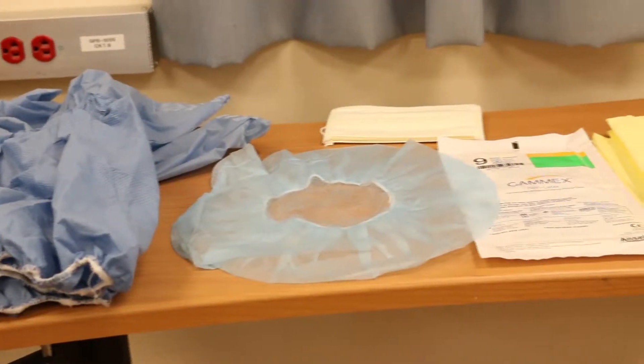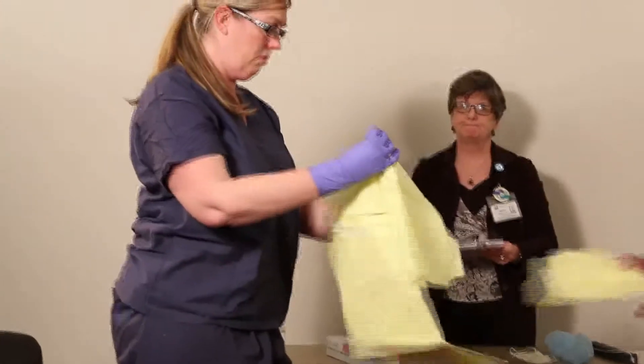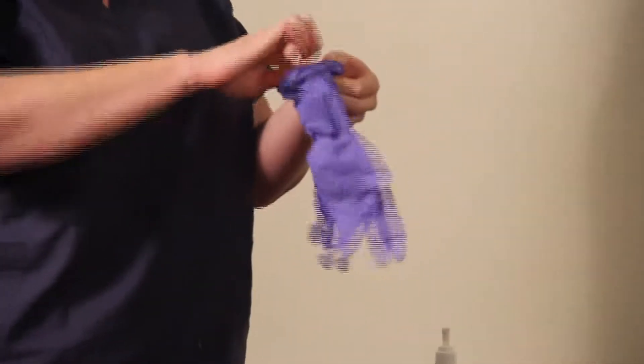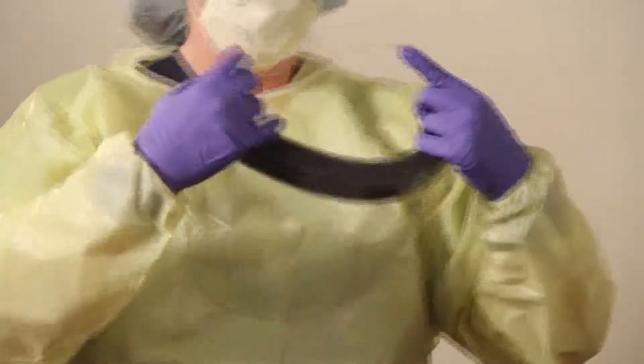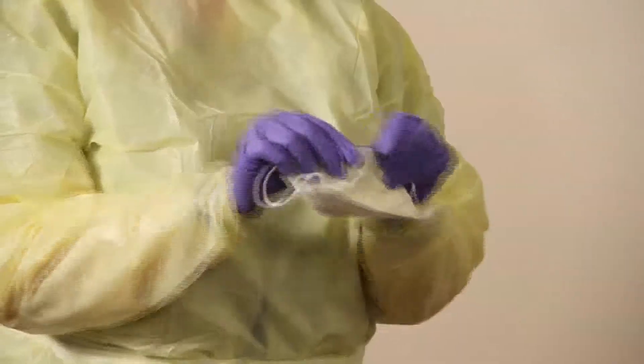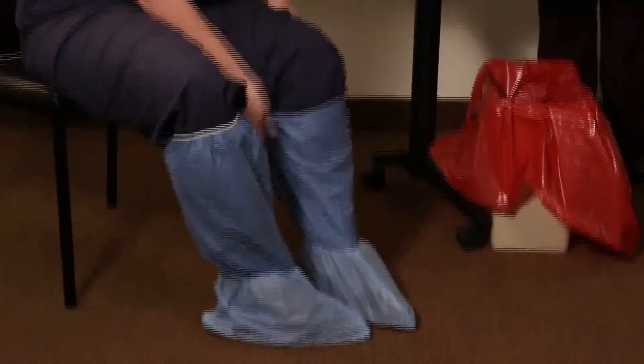For low-risk situations, this includes an impervious isolation gown — you will need two of these. One pair of surgical gloves and one pair of exam gloves. Surgical cap or hair cover. Full face shield. Procedure mask with ear loops or ties. Tall surgical booties.